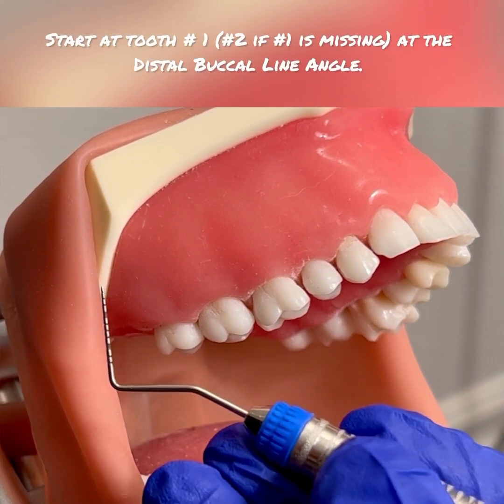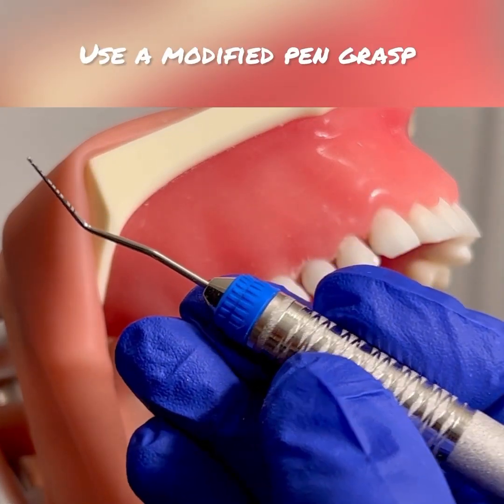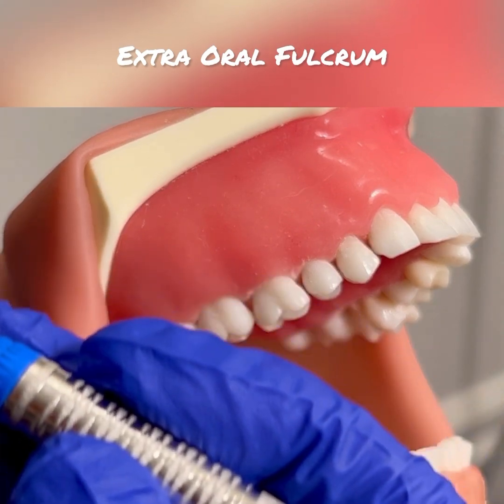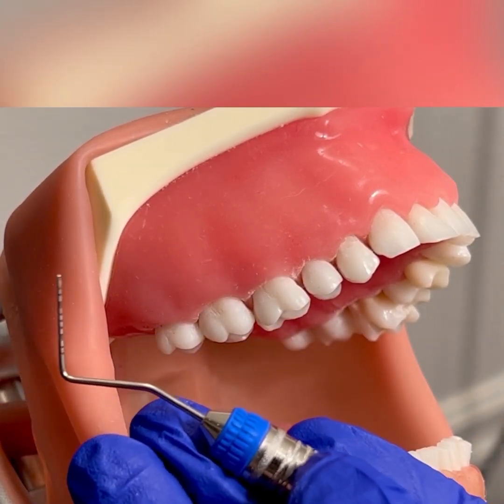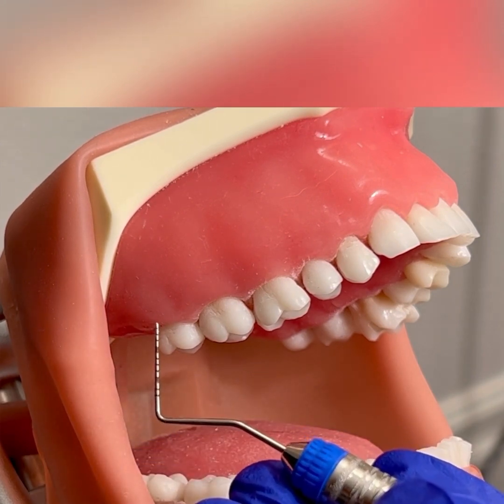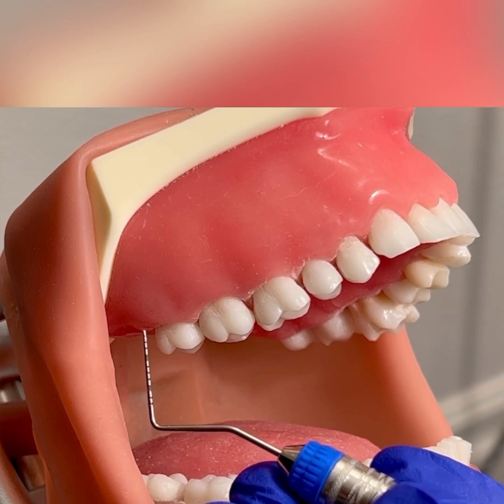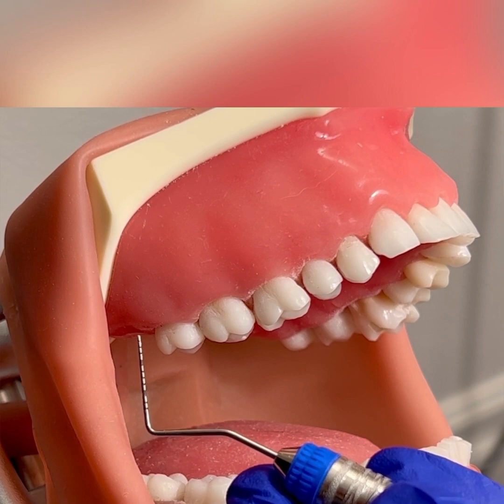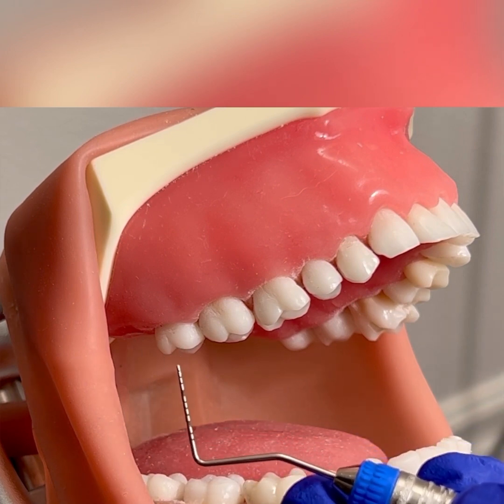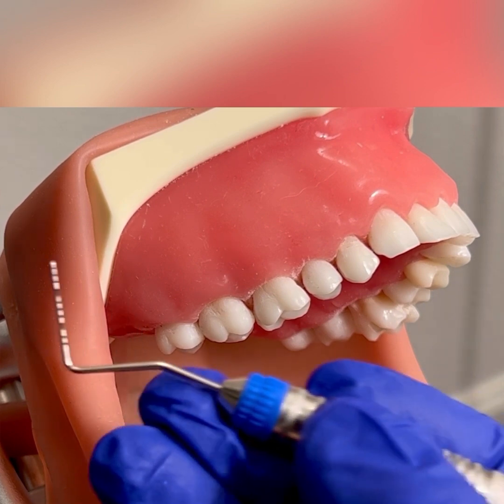The probing sequence starts with tooth number one on the buccal surface. I have a modified pen grasp. I'm using an extra oral fulcrum where the back of my hand is resting on the mandibular arch. My patient's chin is up because I am working on the maxillary arch. For right-handed clinicians, you'll sit at 8 to 9 o'clock and the head of your patient is slightly turned away. For left-handed clinicians, you will sit at 3 to 4 o'clock and your patient will be turned towards you, also with an extra oral fulcrum.